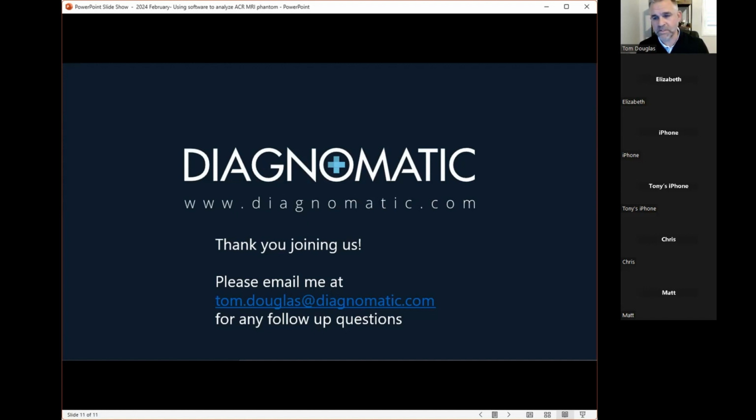The other thing too is we just recently added this, so we're definitely on the hunt for getting our hands on as many different DICOM images as well. Whether you have customers or you're a user of the software or interested in being a user of the software, if you can get DICOM images from the ACR Phantom, it allows us to optimize the software. For helping us out with that, we'll give you 3 months free of using the software for one of your customers or for an end user.